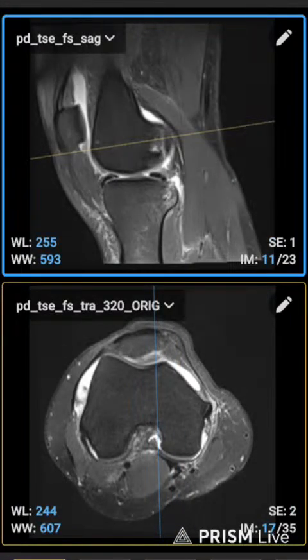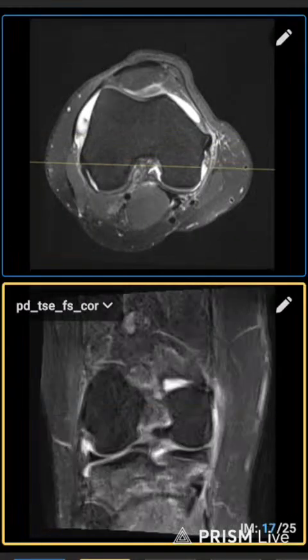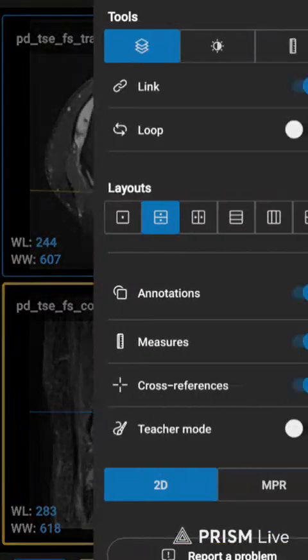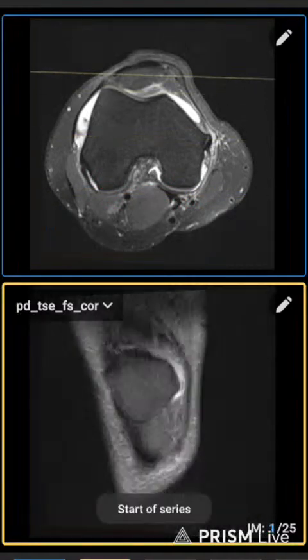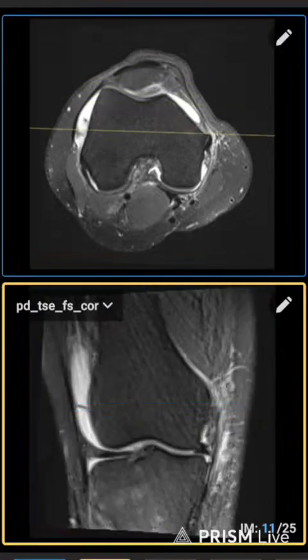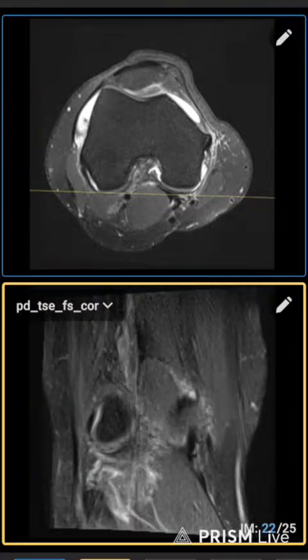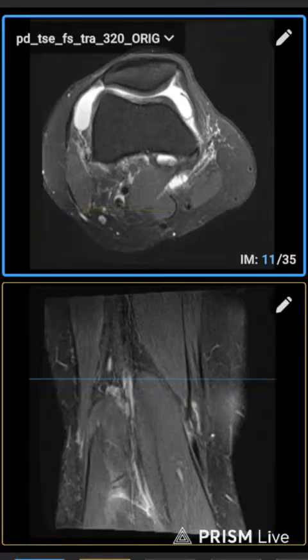In this image, here you can see both end points are perpendicular, and the slice started from the middle of the patella and went past the femoral bone end. You will add that much area.